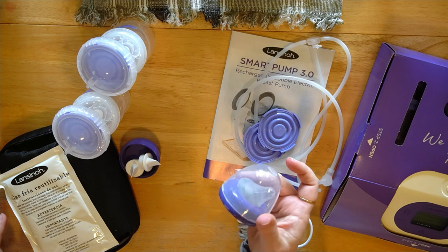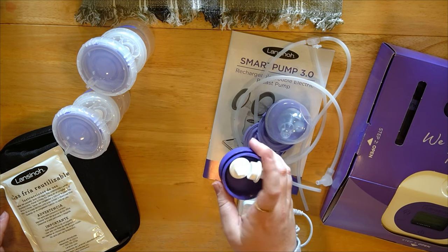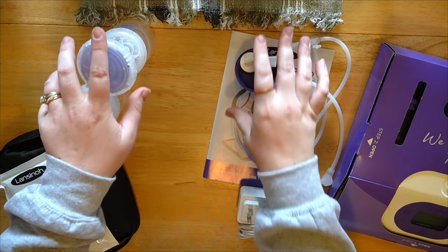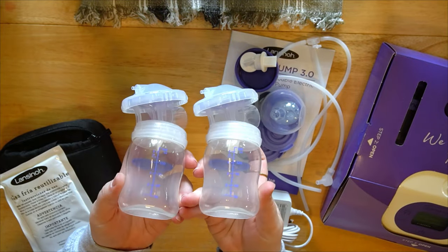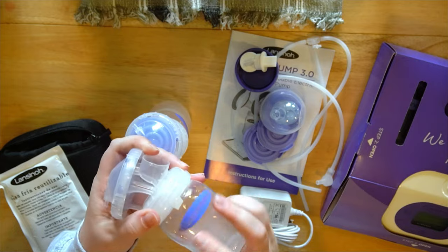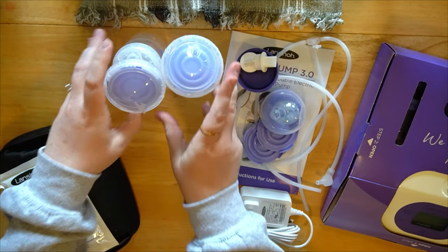You've also got one bottle lid and a nipple, a couple of bottle caps, and a couple extra duckbill valves, as well as a couple of storage containers along with the membranes and duckbill valves in there as well. That's the initial setup.